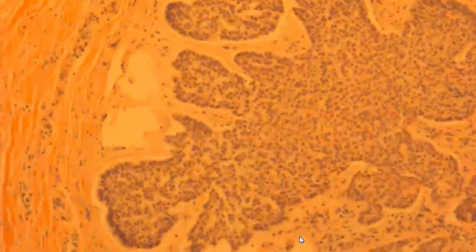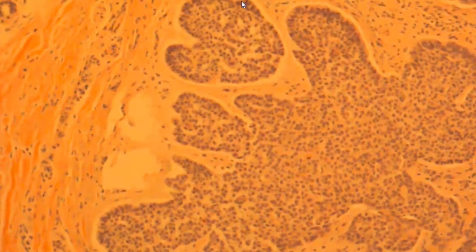So this is the high power of the same tumor, and as you can see here, what we mentioned on the low power, the stromal retraction, is more evident on this high power. We are now at 10x, and you can see the palisading surrounding the lesion.